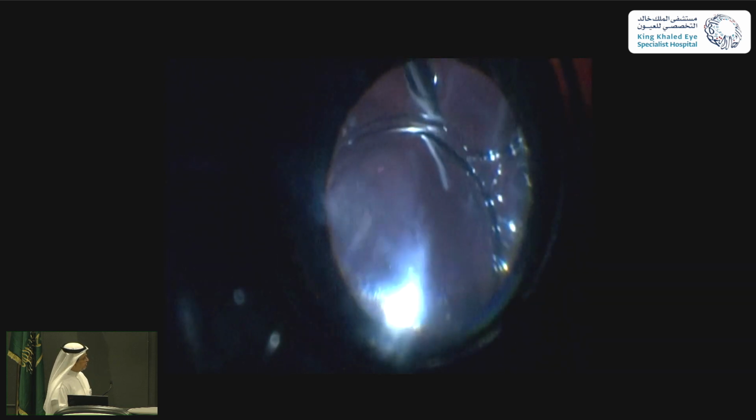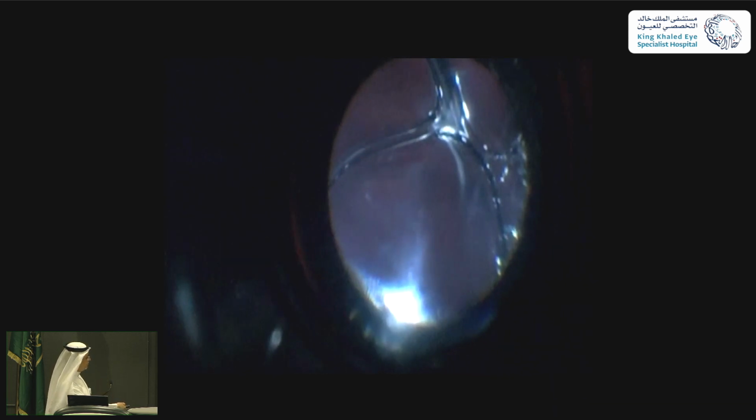Now, this is the cutter. Vitrectomy started under air, not under fluid, and they directed it toward the break. You can see the break on the right side of the video.